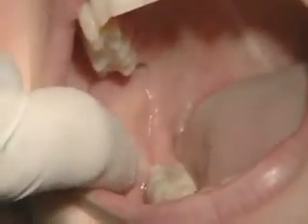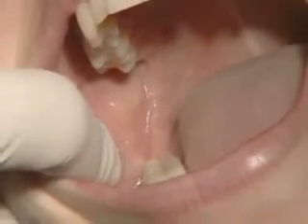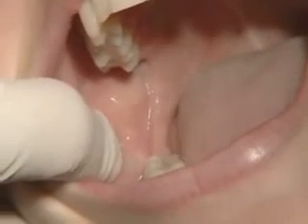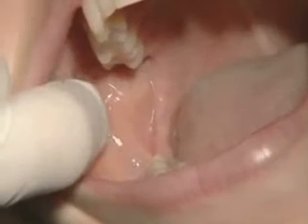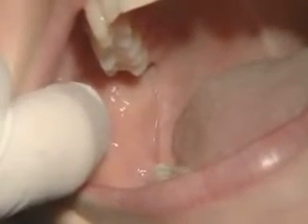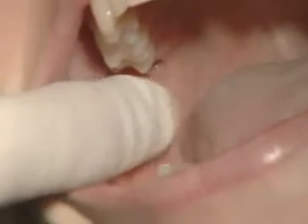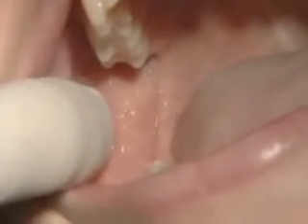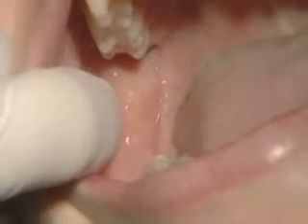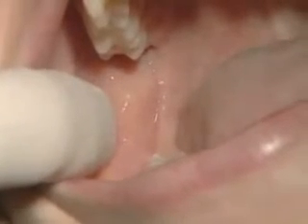As with all three techniques, you start off by feeling the anterior border of the ramus. My finger is now in the coronoid notch and the external oblique ridge, and I move it upwards, superiorly, until I feel the coronoid process. At this point, I can feel the insertion of the temporalis muscle. It's important to not insert the needle within muscles, so this acts as a lateral guide for the insertion of the needle point.